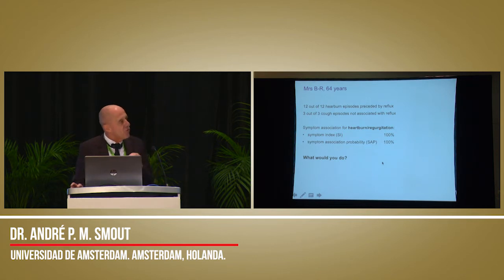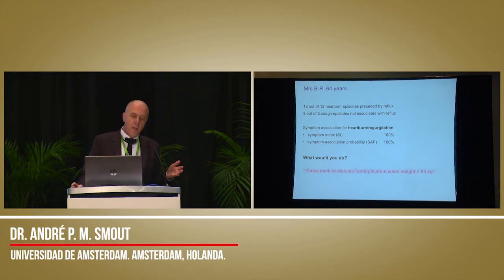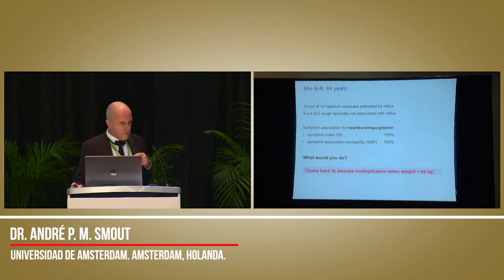And people who don't do this analysis, they don't wish to see the beauty of it. If you have a patient like this, then you can be sure that the patient's symptoms really are caused by reflux, and she might perhaps benefit from an anti-reflux procedure. In this case, we said no, just come back if you have lost more than 30 kilograms, and we'll talk again.